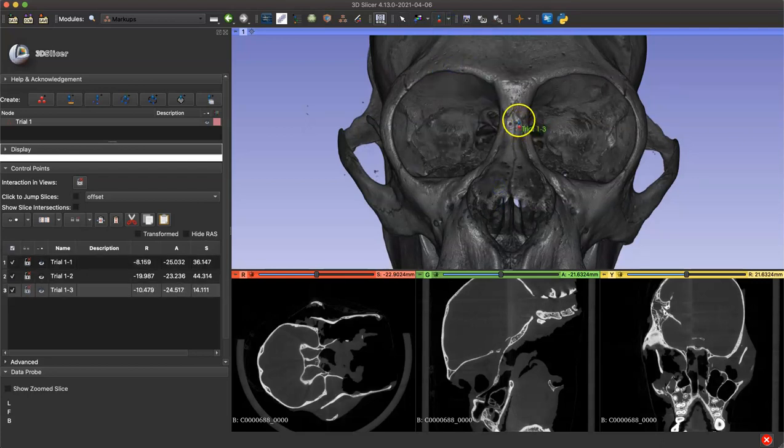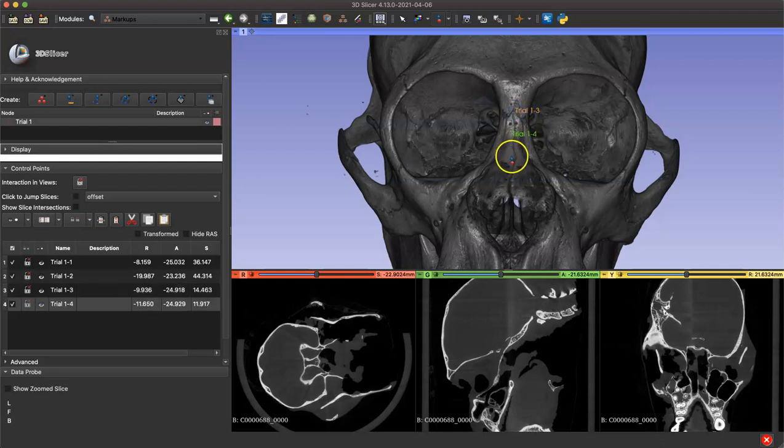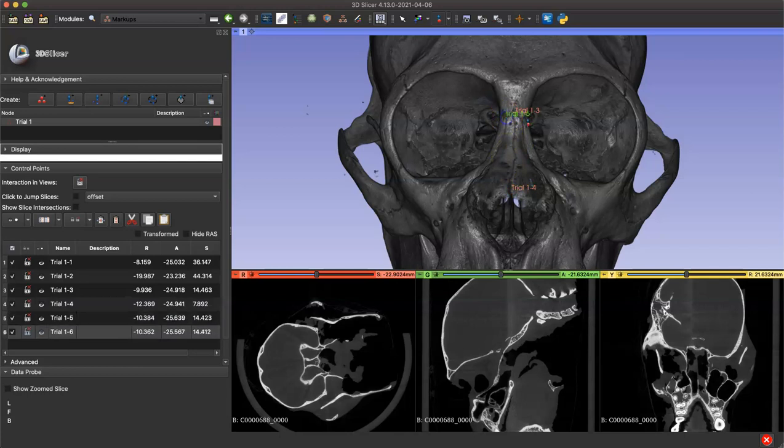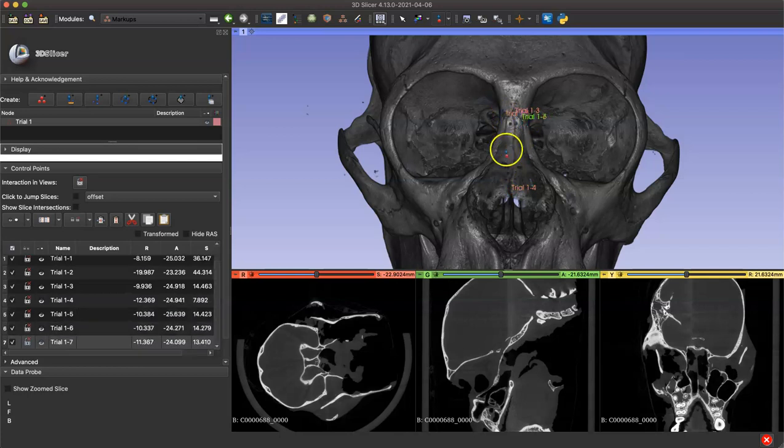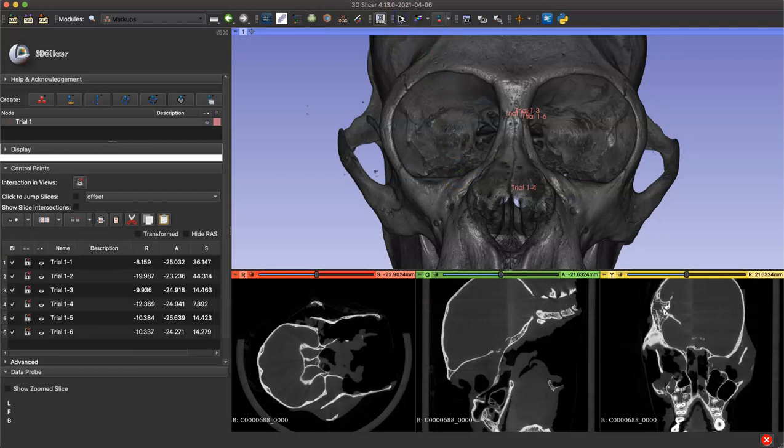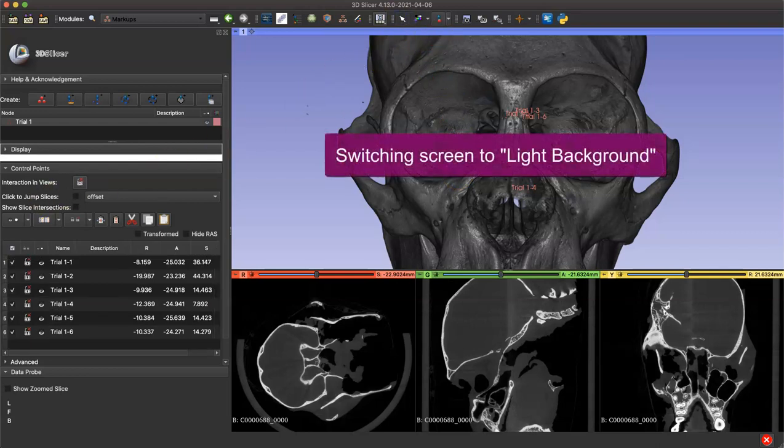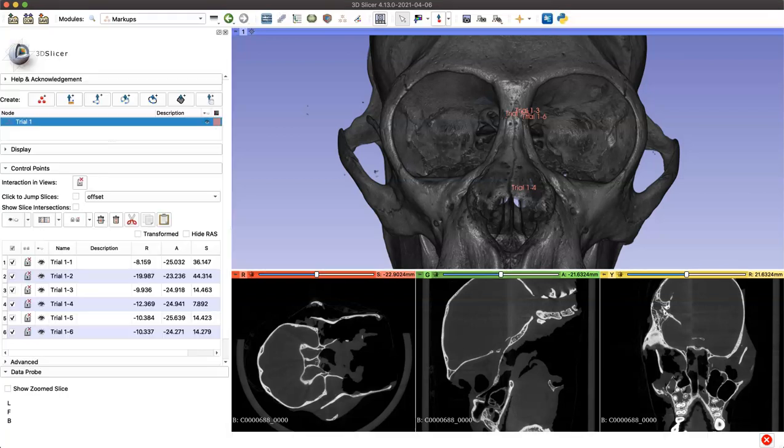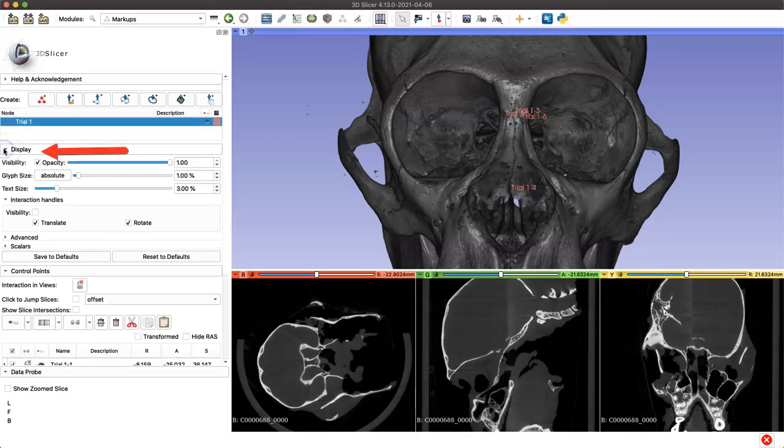Notice that the new points I'm putting down say trial 1-4, 1-5, etc., because we're still under the same node that we created. I'm just continuing that list. I'm going to exit out of active landmarking mode now, and I'm going to switch the appearance of the screen to a light background just so we can visualize this a little better.